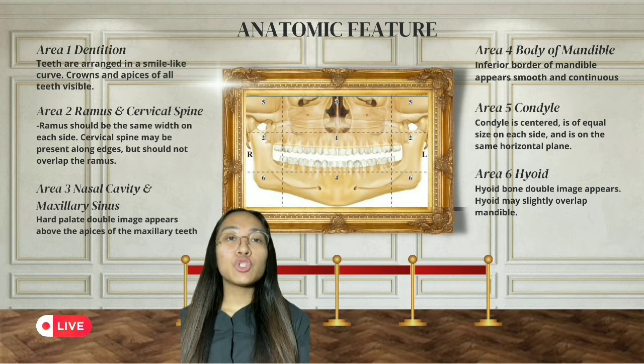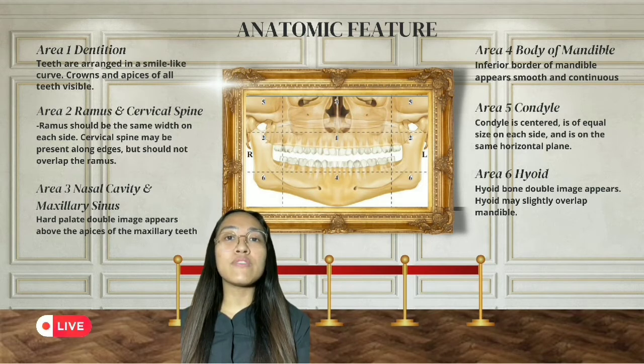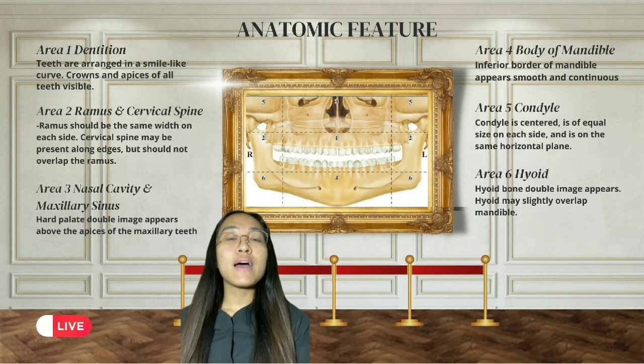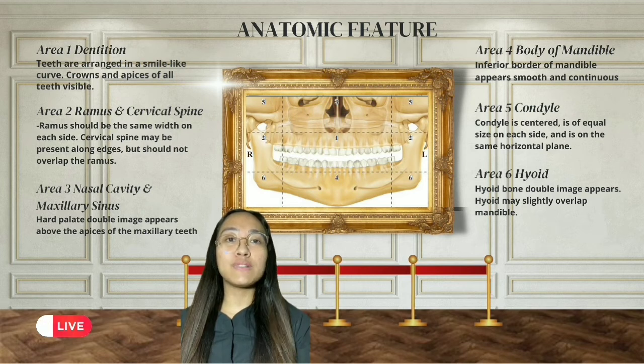Each image should be assessed to determine if the dentition and bones of the maxillofacial region are representative. Assessment of acceptable dentition features includes the following. Anterior teeth are in focus with pulp chambers visible. Anterior teeth are not excessively narrow or wide, and posterior teeth on the right side appear similar in size to the posterior teeth on the left side.